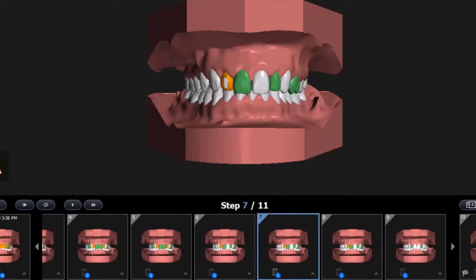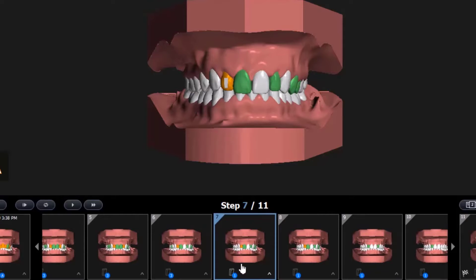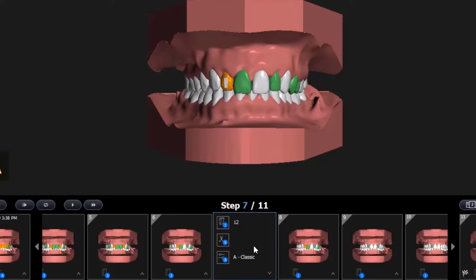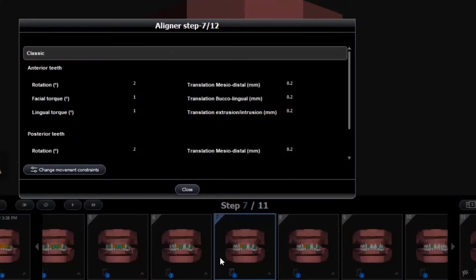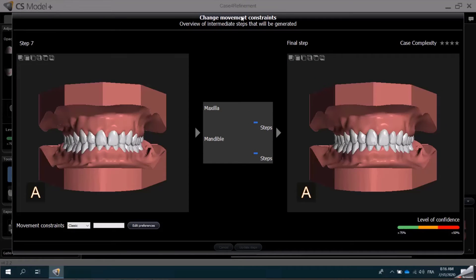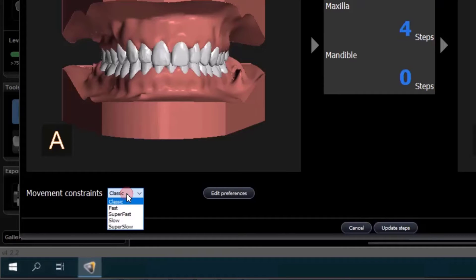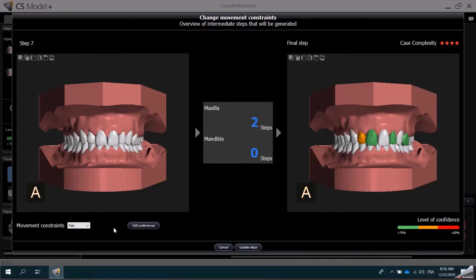I can also change the movement constraints for a specific step. In this case, at Step 7, I am going to change from Classic Movement to a Faster Treatment mode. I'll click the Movement Constraints, and then I'll select Change Movement Constraints from the Aligner Step window. CS Model Plus reverts back to the Preview mode, and I can see that we are on Step 7 with four steps remaining. I can change the Movement Constraints from Classic to Fast, and CS Model Plus will automatically perform the calculation. Instead of four steps remaining, there are now only two.